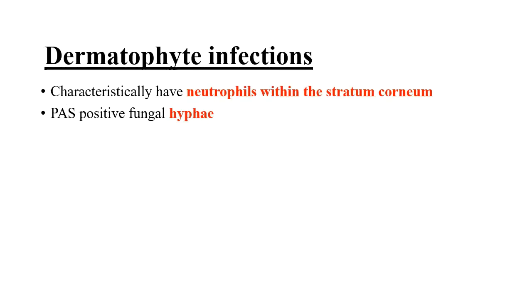Next differential is dermatophyte infections. They characteristically have neutrophils within the stratum corneum. PAS positive fungal hyphae are seen.